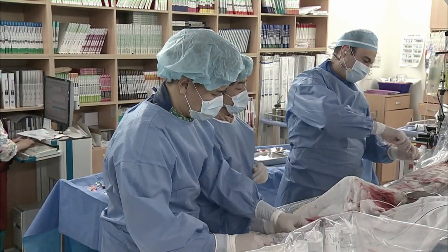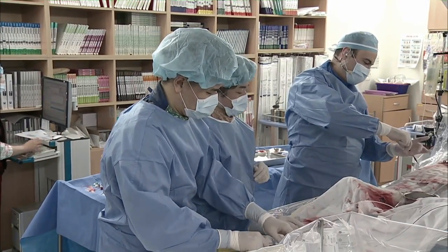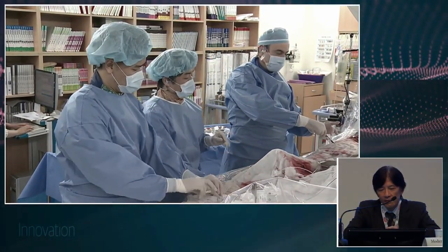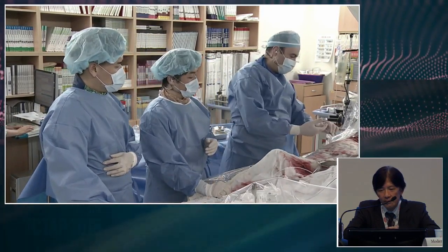Dr. Dimitri, you are on the air. Hi, how are you? We're doing well. So we can show you the pictures. Dr. Kim can go through the history, and then we'll tell you what we've done so far.